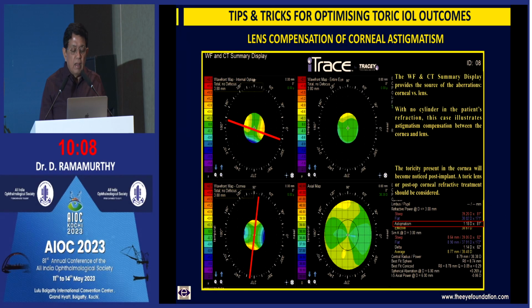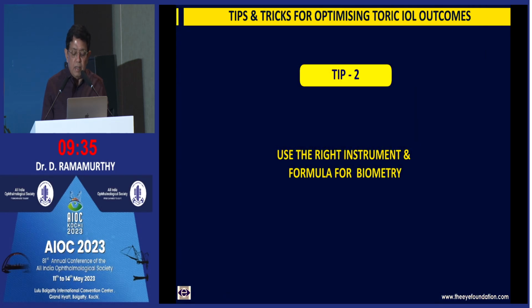On the other hand, these are practical examples, you can have a situation like this where the lenticular astigmatism and the anterior corneal astigmatism almost tend to neutralize each other. So once the lens is taken out, this corneal astigmatism is going to become manifest. So you definitely need to have a look at the spectacle power, the kind of cylinder that has been there, but do not be guided by that as far as the decision to implant a toric intraocular lens is concerned. It's essentially the anterior corneal curvature which is most important in determining this.